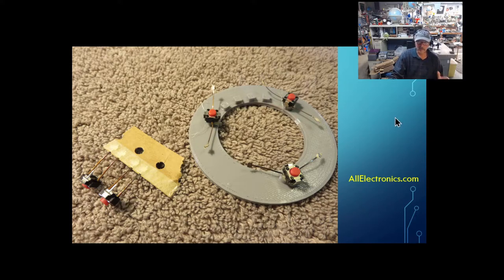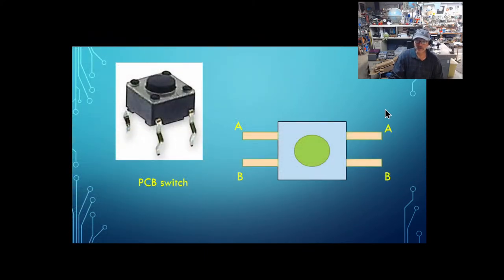Now these are cheap switches, you can usually buy a roll of them, and they're very inexpensive. They also come in several different flavors. I used to use this type of printed circuit board switch, and this will work for this project, too. Just take these little metal tabs in the side, bend them out straight, and I've labeled them A and B.